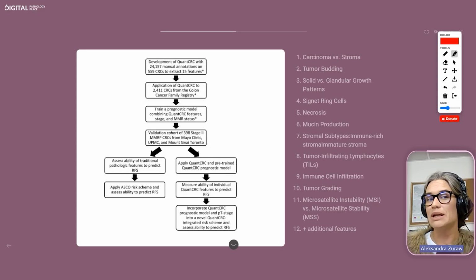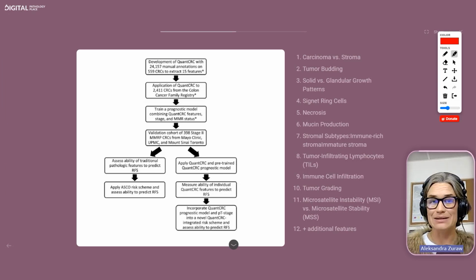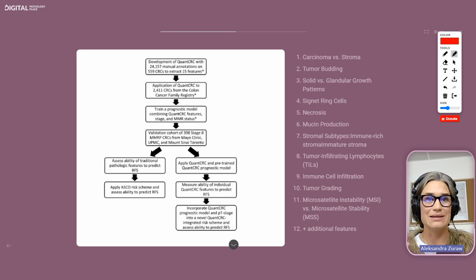Yes. So you mean allowing the machine to learn from examples, right? Yes, exactly. And it started happening in 2016, the first time I took part in a project where I didn't have to say, in an image analysis project, oh, this cell is that round and it has this level of brown.